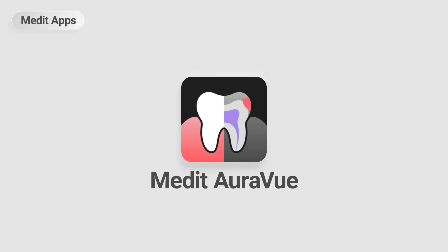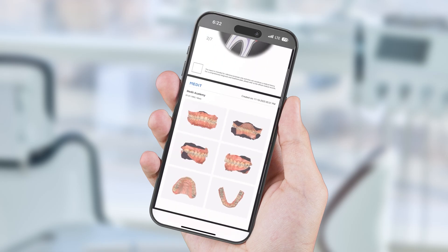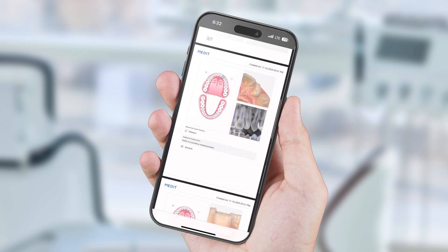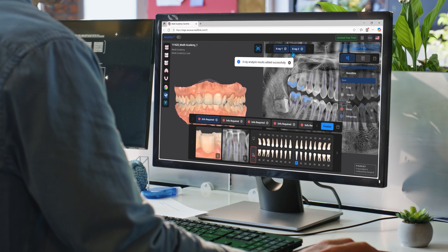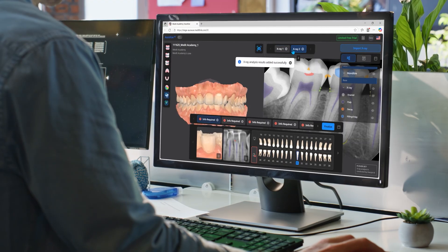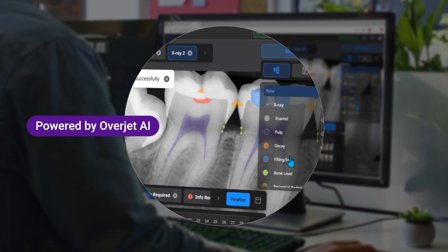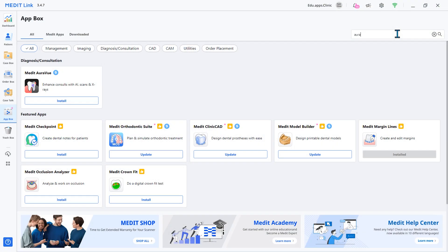Welcome to Medit AuraVue for easy dental reports using scan data and radiographs. Medit AuraVue is an app that quickly and efficiently generates patient reports utilizing scan data and automatic radiograph image analysis powered by Overjet AI. Shall we get started?